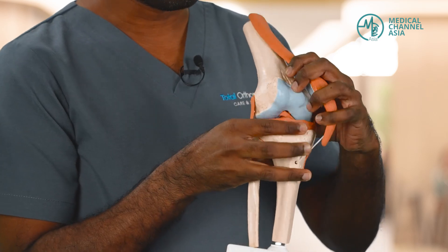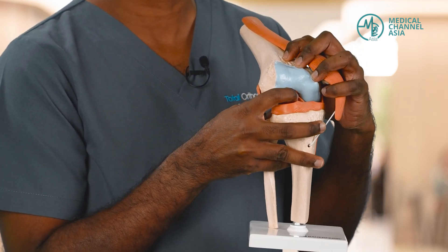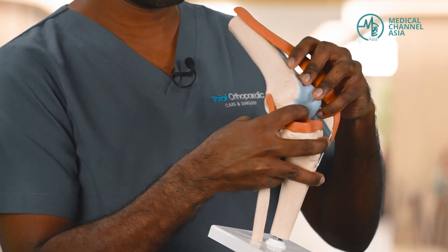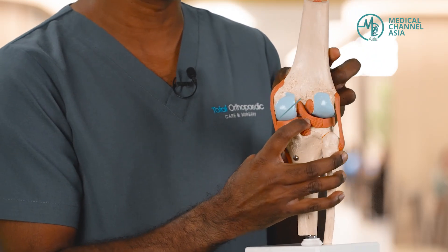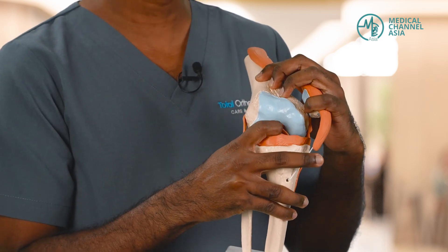Once this is done, we bend the knee and we look at the structures inside the knee. In this model, you can see at the centre of the knee are your cruciate ligaments. At the front, we have the anterior cruciate ligament, otherwise known as the ACL. And at the back, you have the posterior cruciate ligament, otherwise known as the PCL. We are able to assess these ligaments and their integrity through arthroscopy.